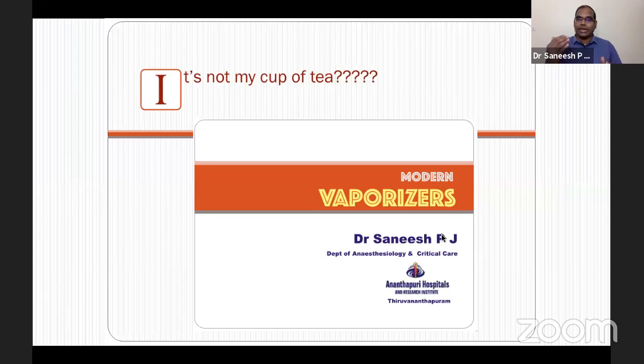My idea is to give you an idea how to approach when you are given a vaporizer in your exam, viva. Mostly if you are given two equipments together, try to compare property by property. This is a flow over, this is an injection type vaporizer, like that. Property by property, you compare and proceed. To practice that, first you have to practice with a single equipment and practice along with the classification first. And if you know further the inner working details, then you volunteer. Otherwise, if you start memorizing everything in the first go, you won't get that flow. So this is my method, no hard and fast rules. This is something which helps me personally, I think.